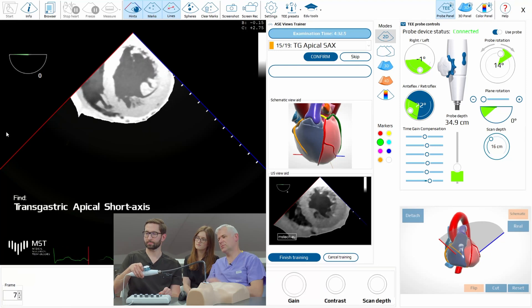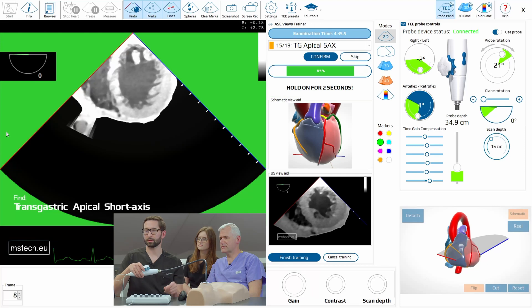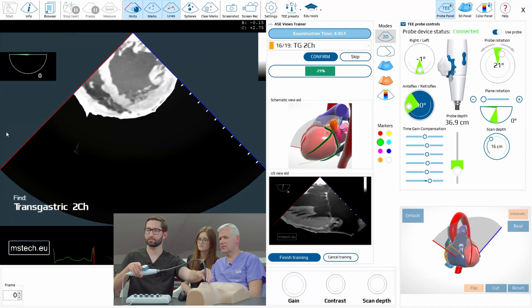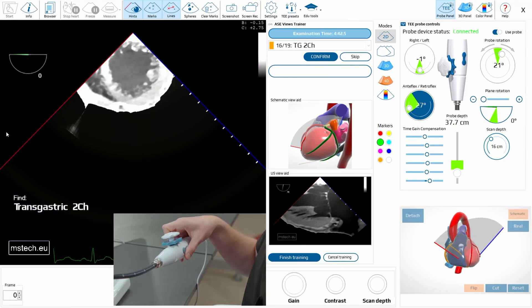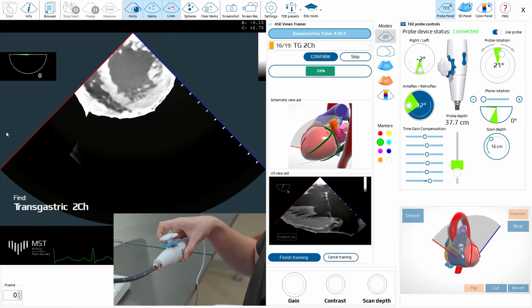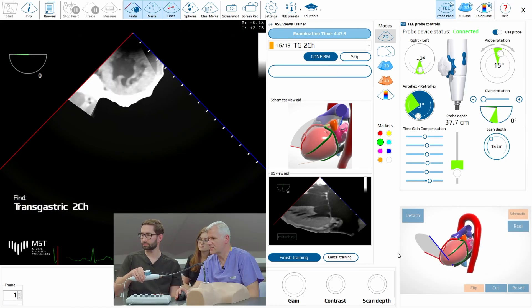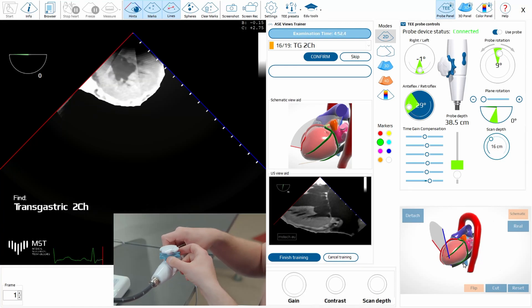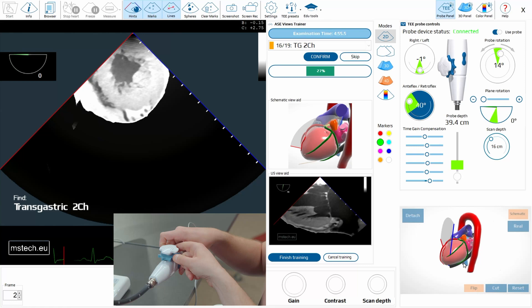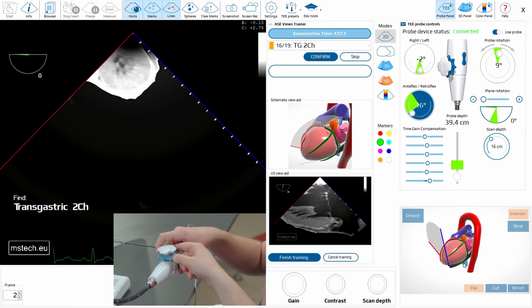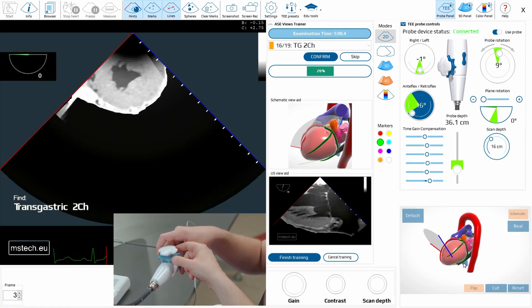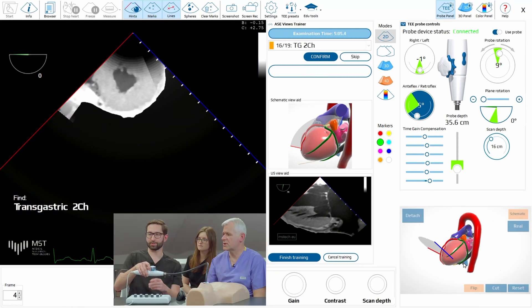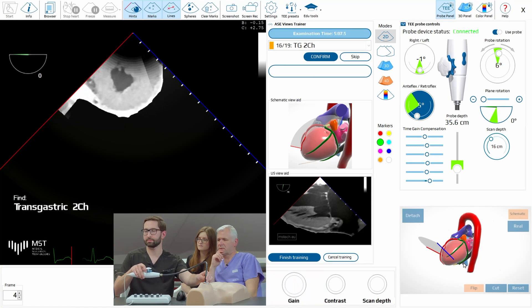Transgastric, so you have to be more towards the apex — even more, very apical. If I look here, you have to be very apical and do a little anti-flex. A little, not too much. It was done, and now the two-chamber — 90 degrees now.